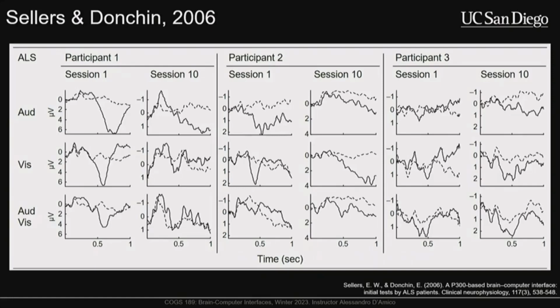little noisier. And in participant 2, we see something that looks like a pretty strong, peaky P300 on visual, but in auditory, it's a lot more jagged. This means that it's probably more variable, or the signal is just not as strong. And then participant 3 has very difficult data to discriminate.